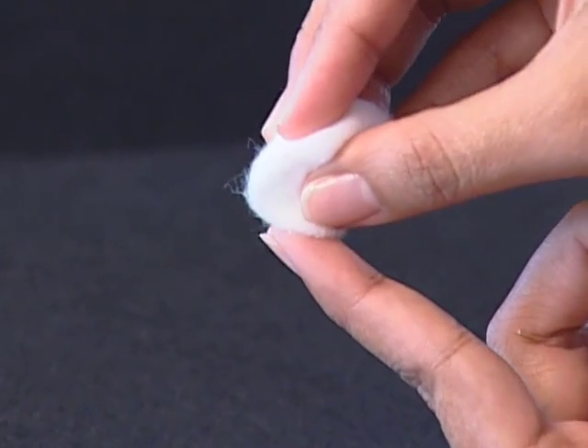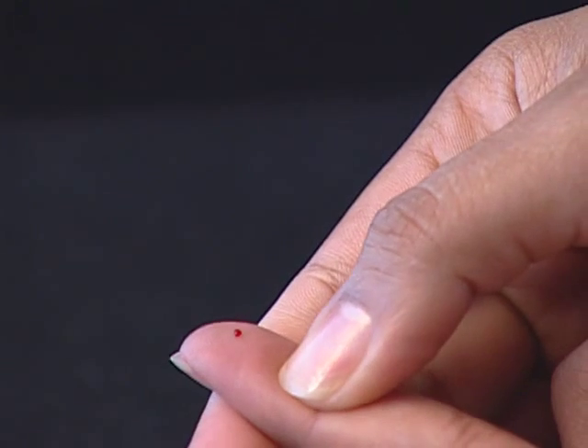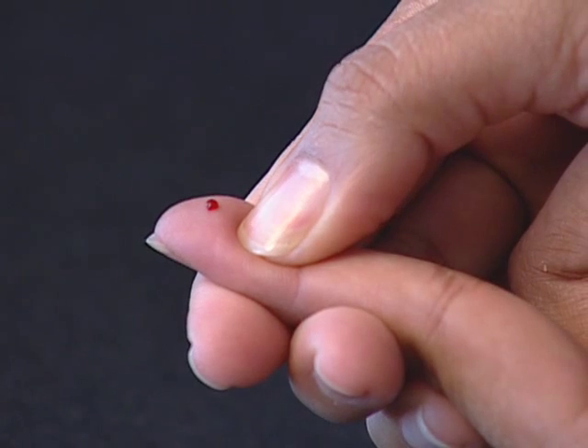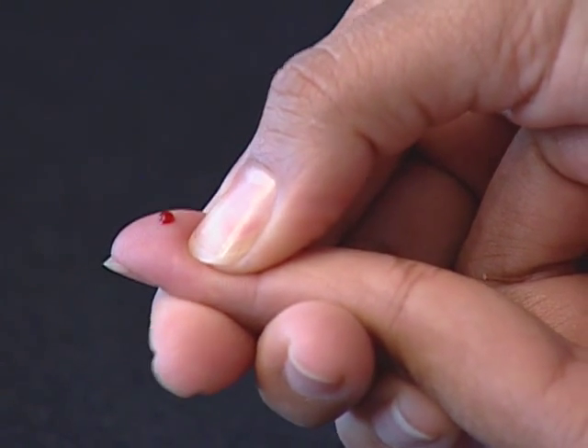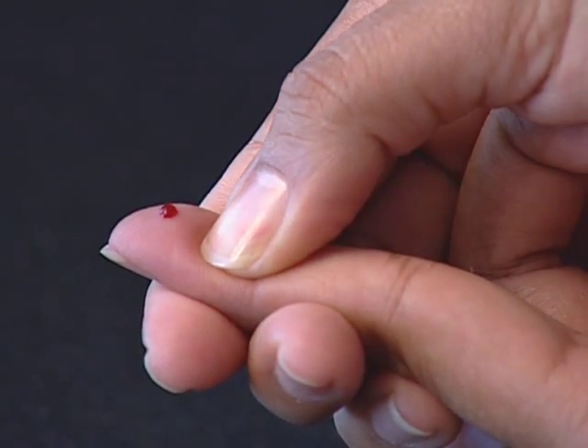After penetration, discard the first drop of blood with a clean tissue paper or cotton. The first drop of blood usually contains tissue fluid and serum which may affect the test result. Choose a different spot each time you test. Repeated punctures in the same spot may cause soreness and calluses.